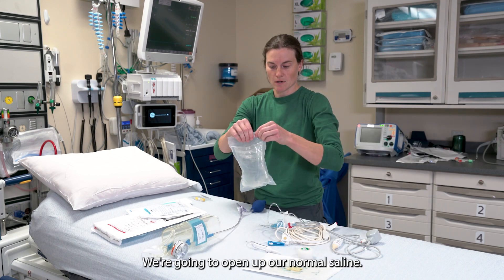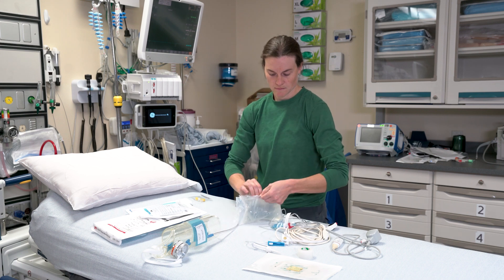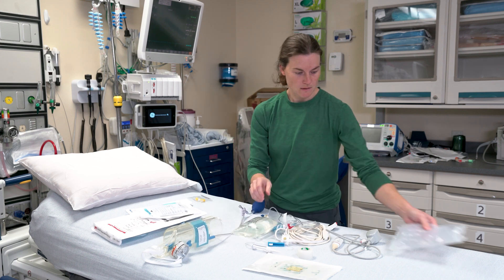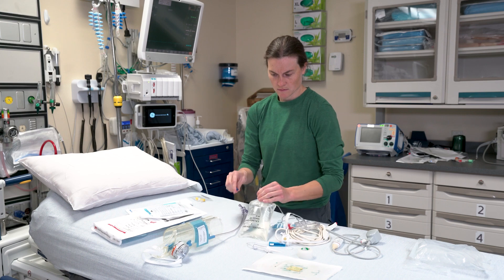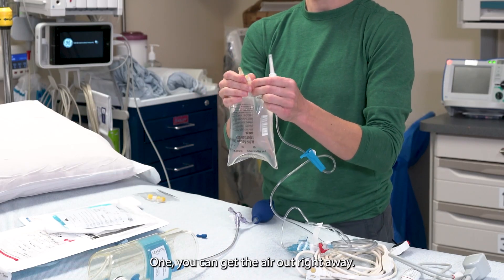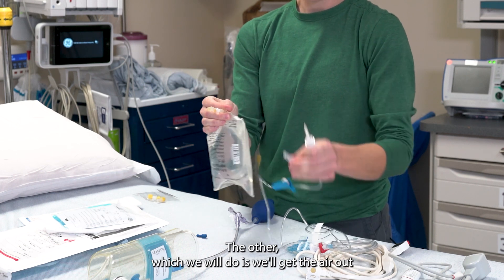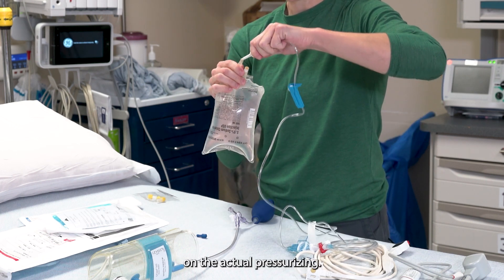We're going to open up our normal saline. Now there are two schools of thought here. One, you can get the air out right away. The other, which we will do, is we'll get the air out on the actual pressurizing.